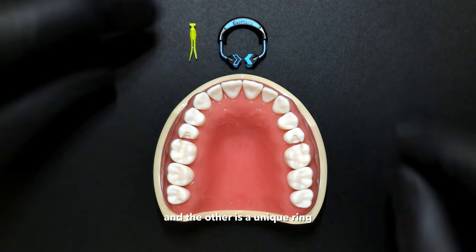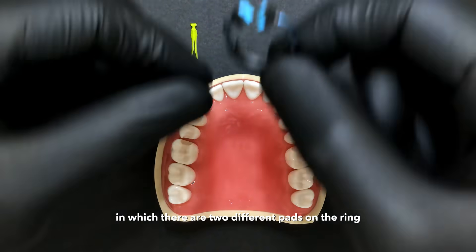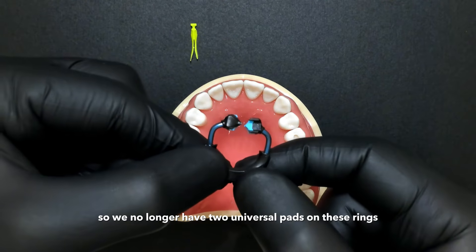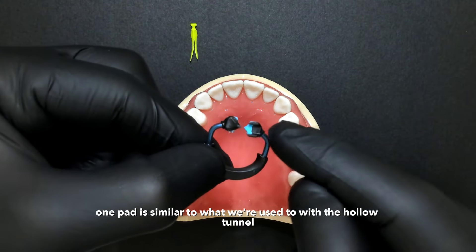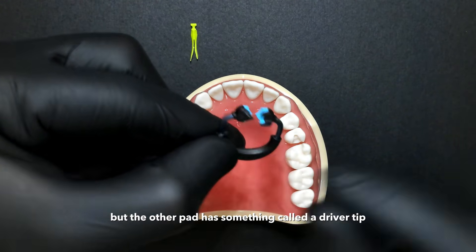The other is a unique ring in which there are two different pads. We no longer have two universal pads on these rings. One pad is similar to what we're used to with the hollow tunnel, but the other pad has something called a driver tip.